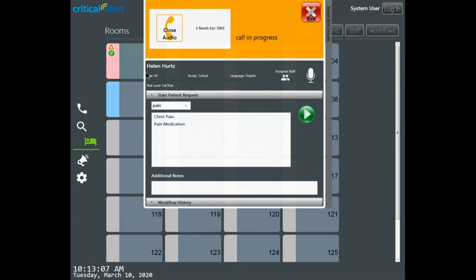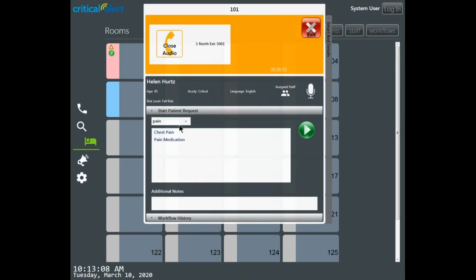This is where we start. We give you a lot of information when you see this call event come in. I know the location, but more importantly, I know the patient. And this is where we change the methodology a little bit. It starts with properly triaging and assessing this patient's need, and that starts with proper communication.